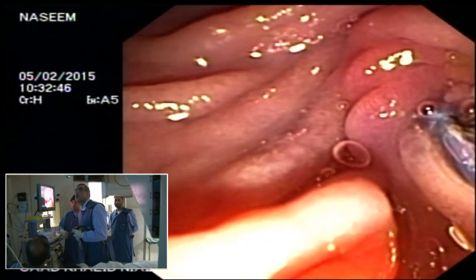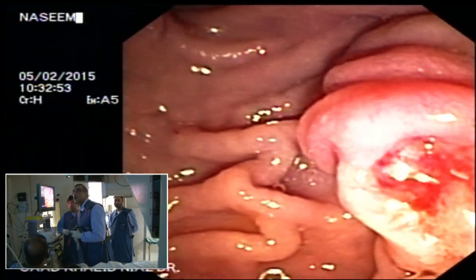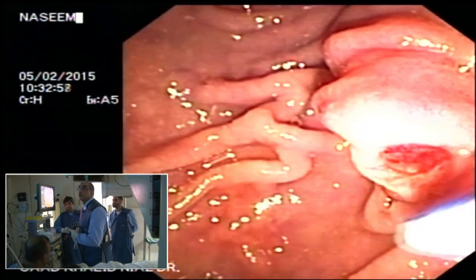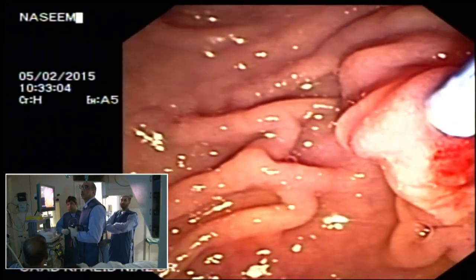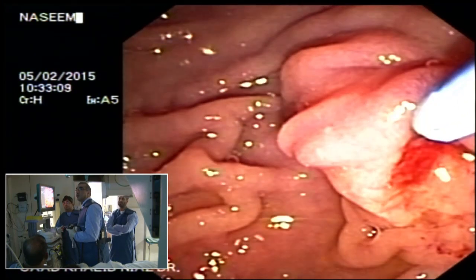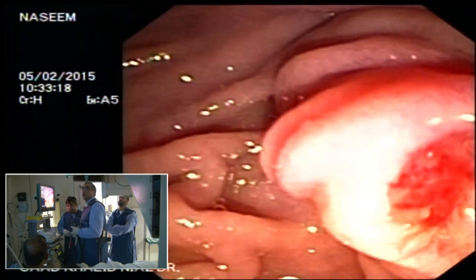In my opinion, for patients with pancreatic cancer, I don't think there's a need for that. These tumors are pretty bad. In cancer-related patients, I don't think you need a pancreatic stent to do a needle knife. But needle knife should be used only 1 to 2% of the time, or maybe at most 3% of the time. If you are using a needle knife in 15% of your cases, you need to change your approach. You're doing something wrong.